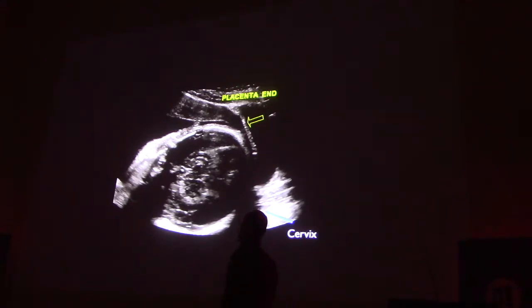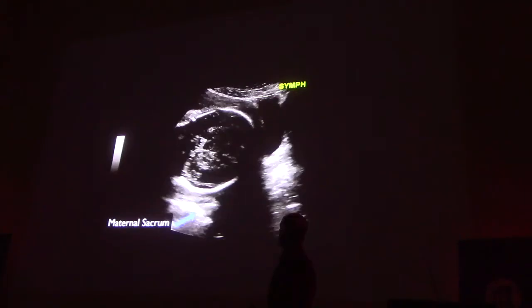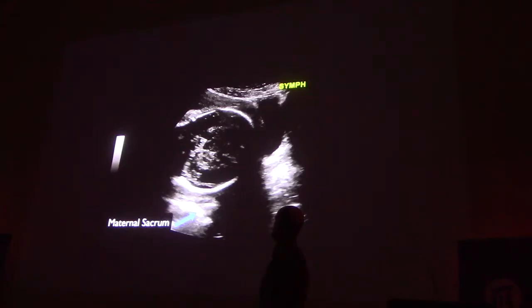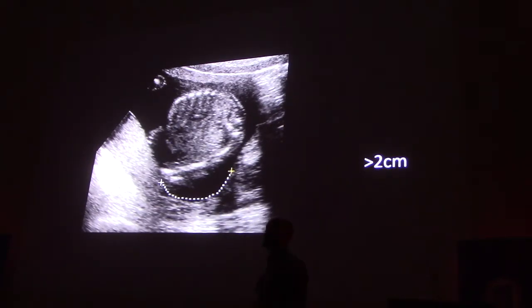This is the baby with the cephalad presentation. Not low-lying, not previa, not really a problem. And here, even though we don't see a placenta, what we have is fetal calvarium, basically abutting the sacrum and abutting the pubic symphysis, which essentially rules out there being placenta there. So you're granted some latitude in ruling out placenta previa in this kind of case. And just a reminder, anything placenta within 2 centimeters of the os, you have to consider as low-lying, and this could potentially be problematic once you have dilation of the cervix during labor. So this could bleed.